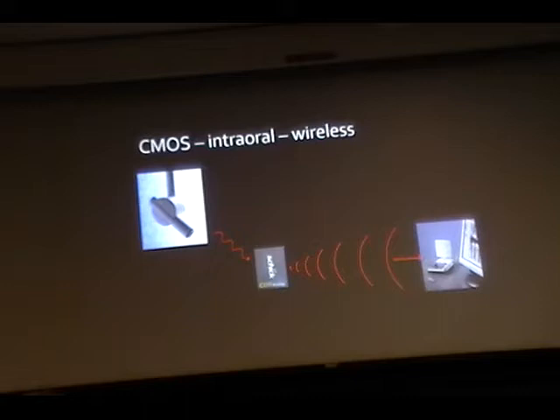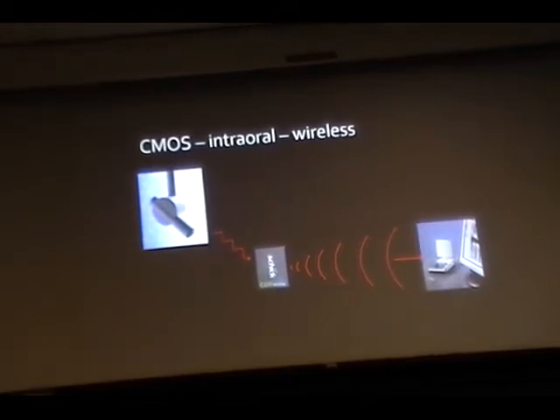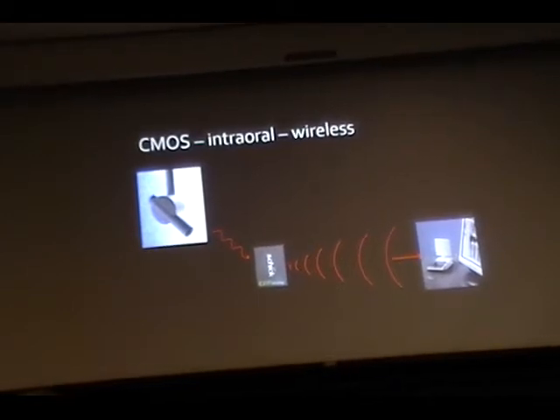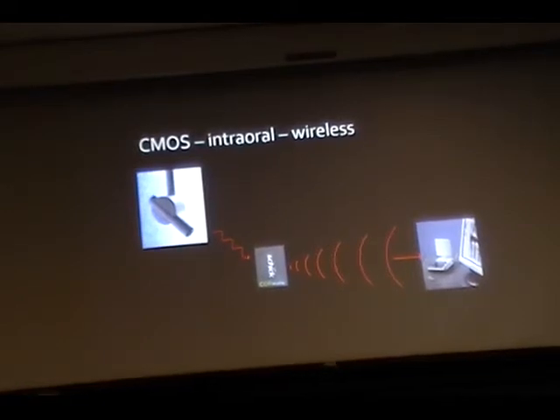Did you drop it? That's a good thing, okay. You've introduced another step there. Now not only is the receptor taking in X-rays, but now the receptor has to transmit that image, I presume, by Wi-Fi technology. But you're going to have to hit that sensor, so what was a one-step process now becomes a 2-step process. So what could be the potential problem?